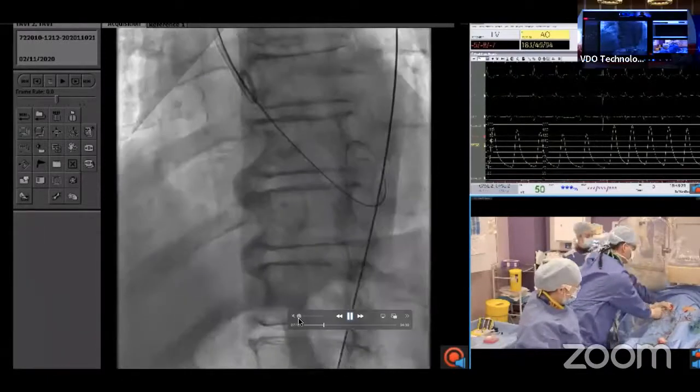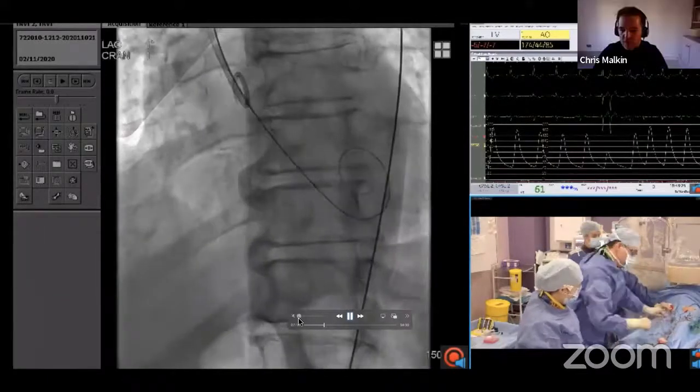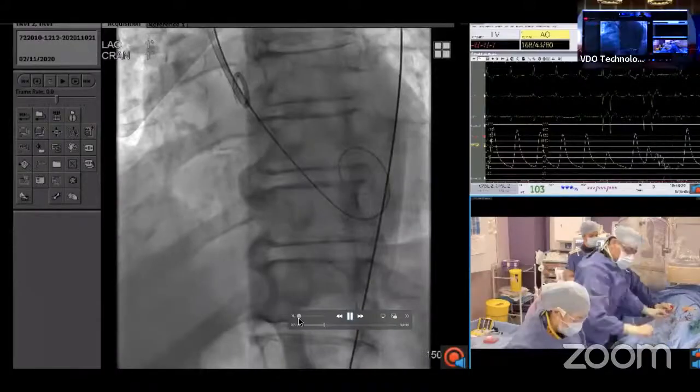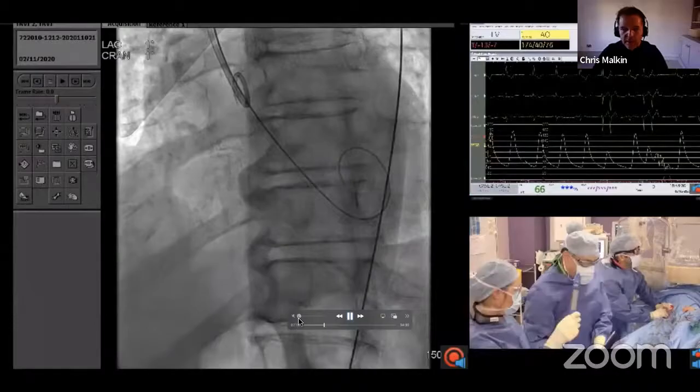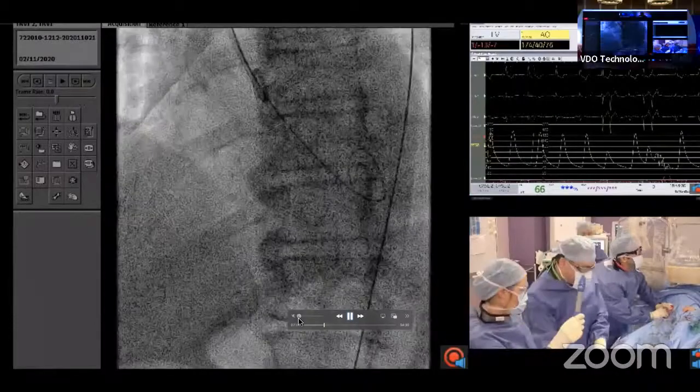So my colleague here is taking out the sheath that we've used to dilate the common femoral artery and iliacs, and I'm going to go straight in with the delivery capsule, as you can see.